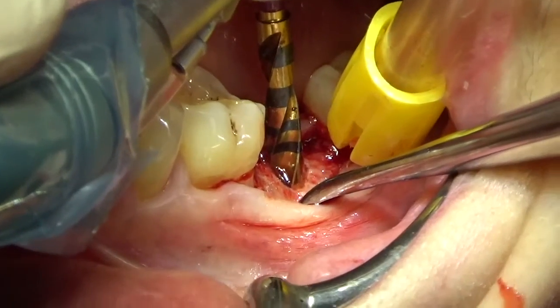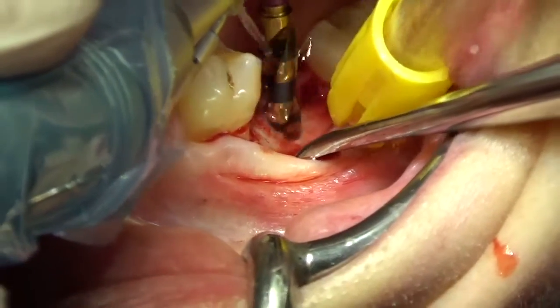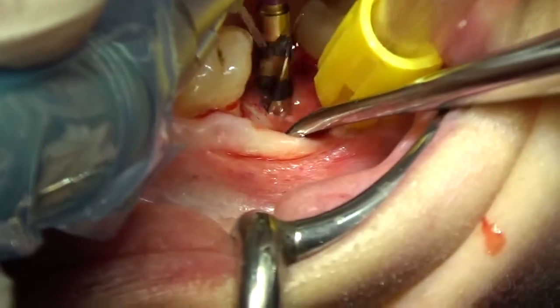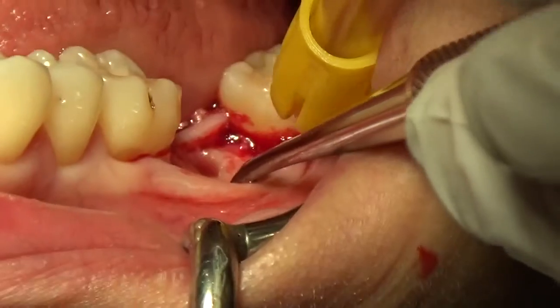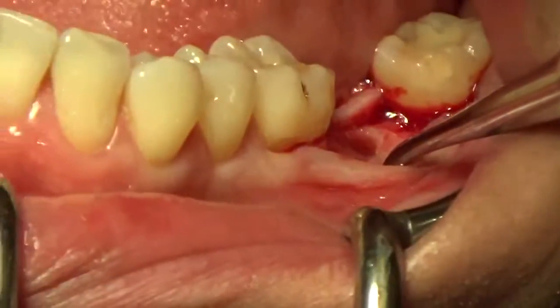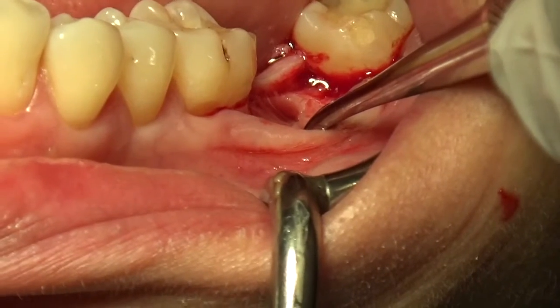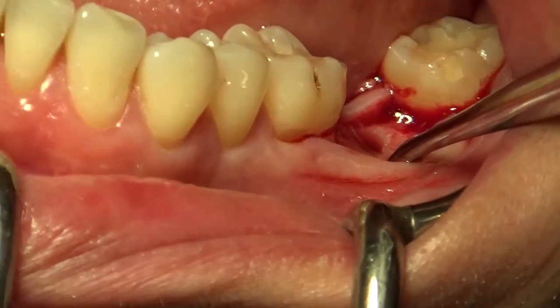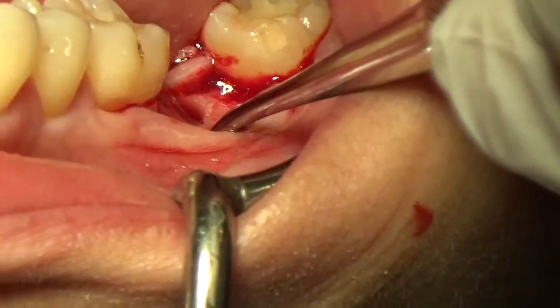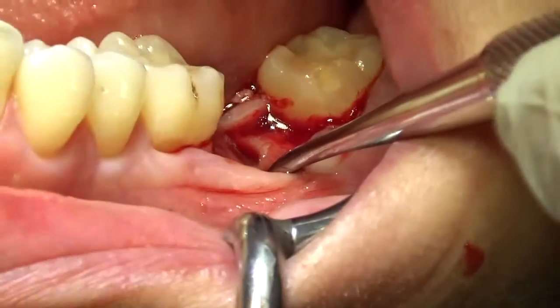So it falls right into our osteotomy there. And it goes all the way down to depth. Yes? So the depth is actually in the lingual bone. Because the buccal, so we planned on there being perhaps a lingual, or excuse me, a buccal dehiscence. Okay.